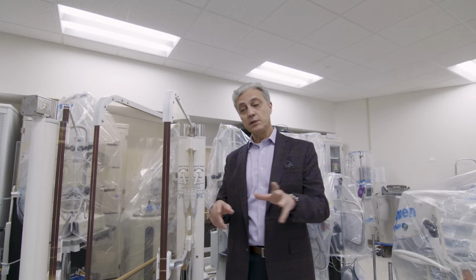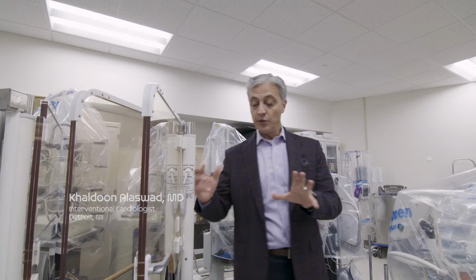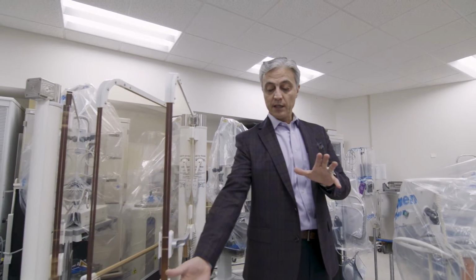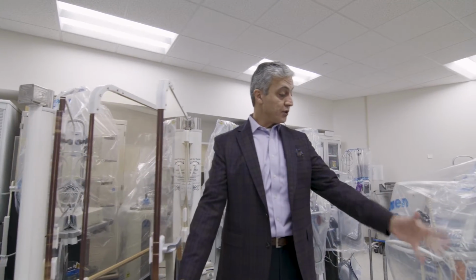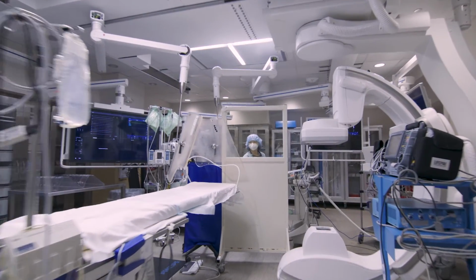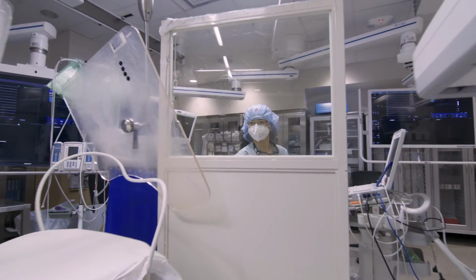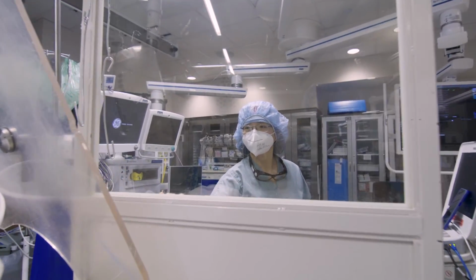Now you have to remember, this only protects the people who are standing on this side of the patient. If a person is on this side of the patient, they have no protection, they still have to wear a lead. So the person such as myself or any anesthesiologist administering the anesthesia for the patients during the case will on average be exposed 11-fold more to radiation than the person standing on the patient's right side of the body.